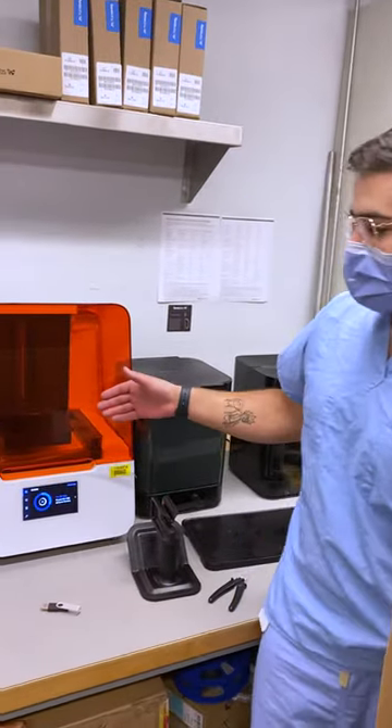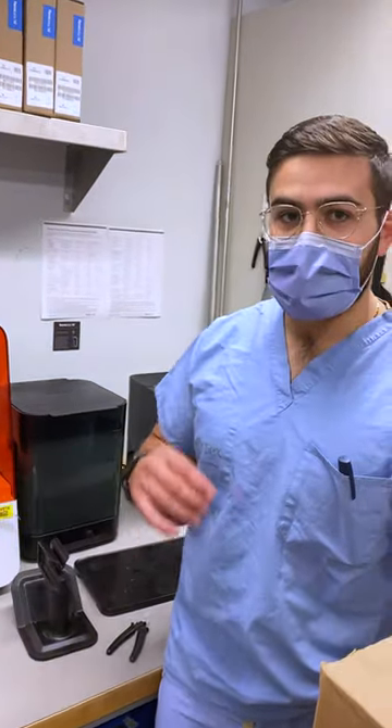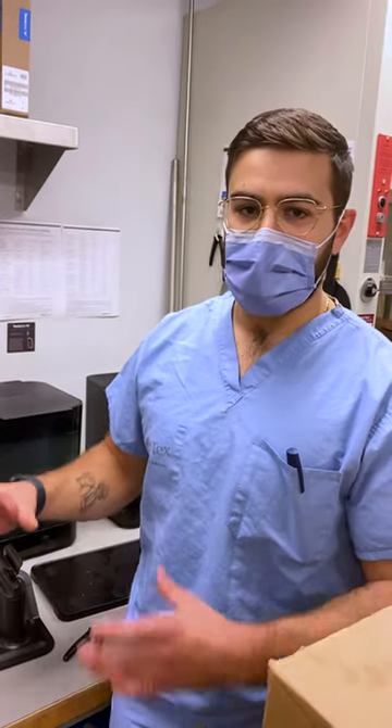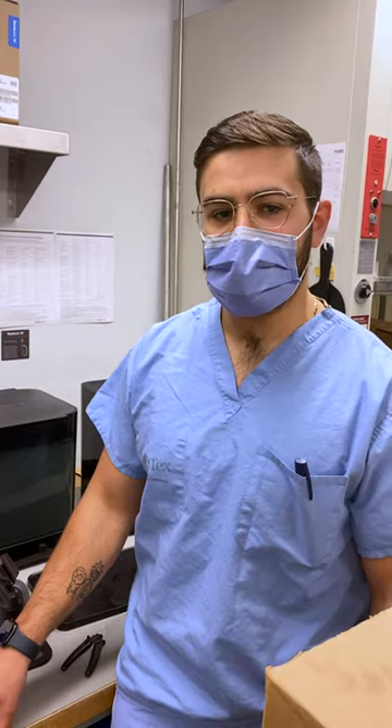This printer here is an SLA printer from Formlabs. Currently being printed is a surgical guide for a maxilla. These are made in a 3D program called 3D Slicer, which we use to edit, model, and create surgical guides and different devices and components here at Sinai.